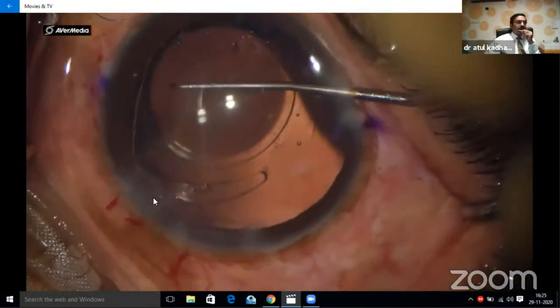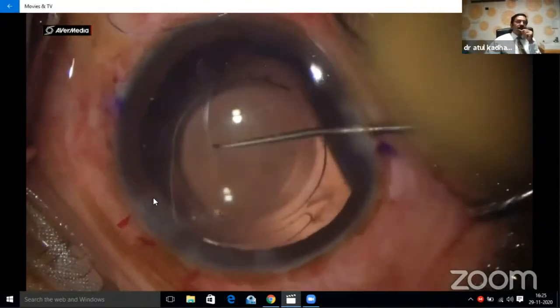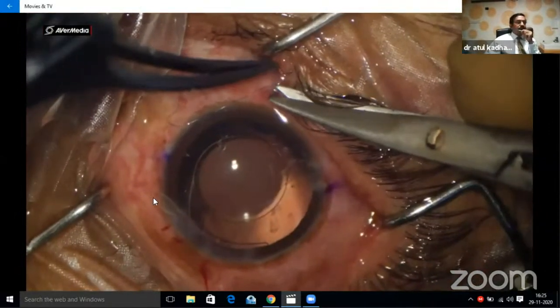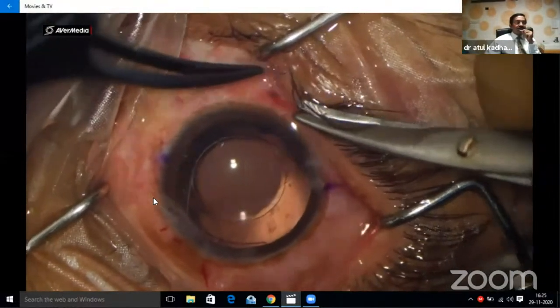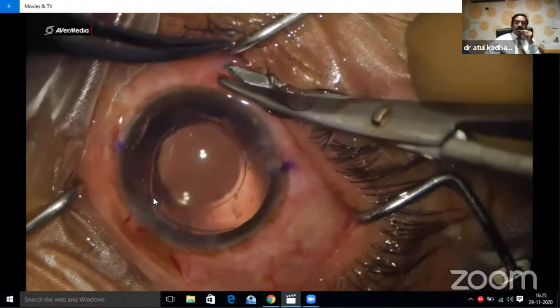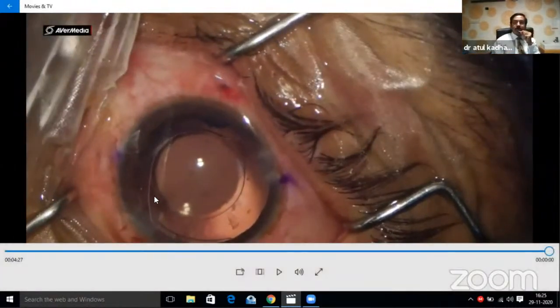The wound we can seal with routine hydration, and thus we can see that the AC anchor facilitates the creation of a well-centered IOL capsular bag complex, and therefore it helps in effective visual restoration postoperatively. The patient is very happy.